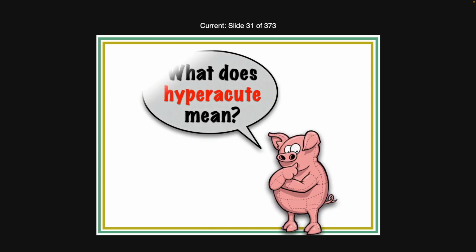And who remembers, what does that term hyperacute actually mean? Over 6 millimeters from the J point. So what does the term hyperacute mean, regardless of whether it's with T waves or just used in a sentence? Very large. Nope. That was quick. Say it again? Quick. Yes. Very quick, very soon. So hyper, you're exactly right, Chris.